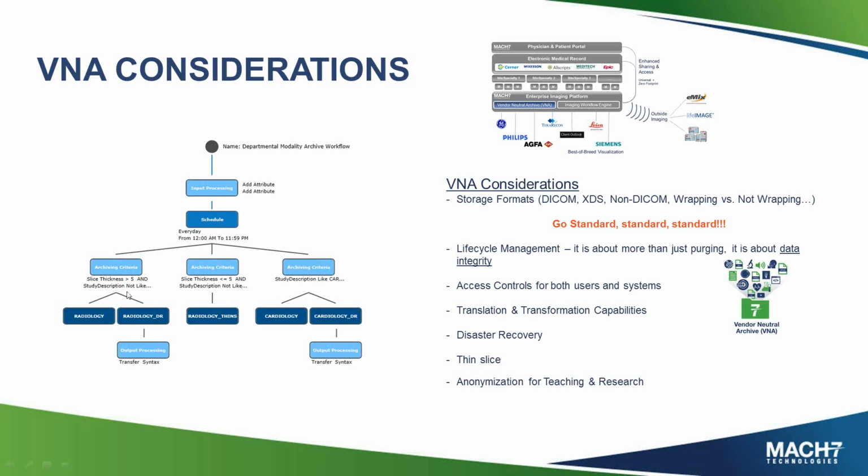For instance, in our VNA, if we're storing into radiology and radiology disaster recovery 100 miles down the street, let's compress it. Let's compress it further. And also, when the PACS queries us, if radiology is down, let's automatically have it fail over to radiology DR without the client and user even knowing.